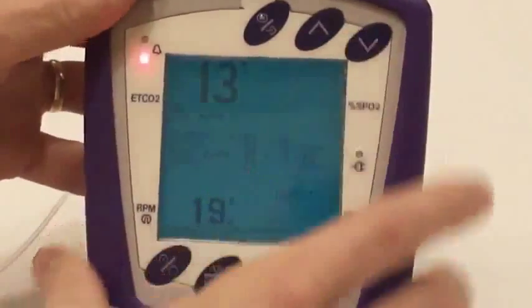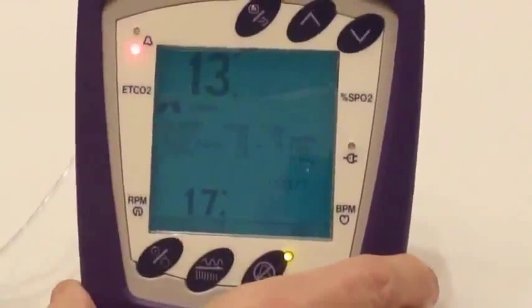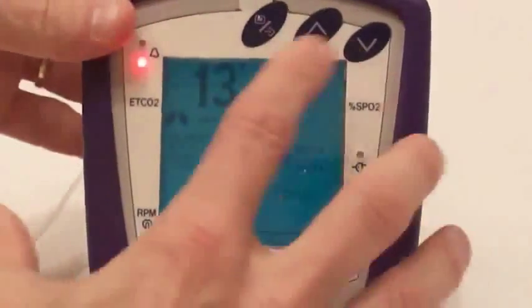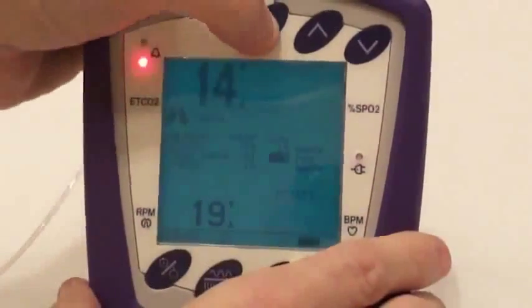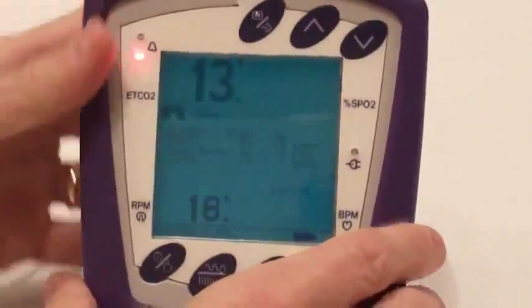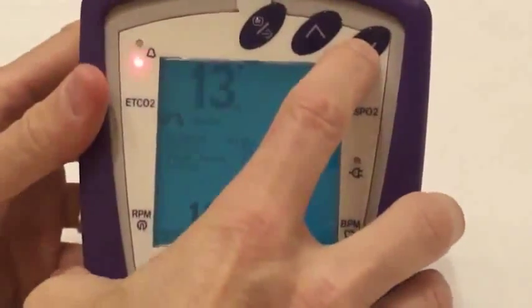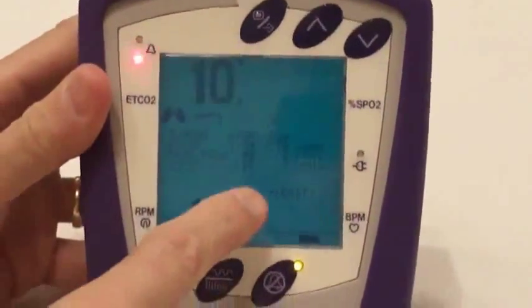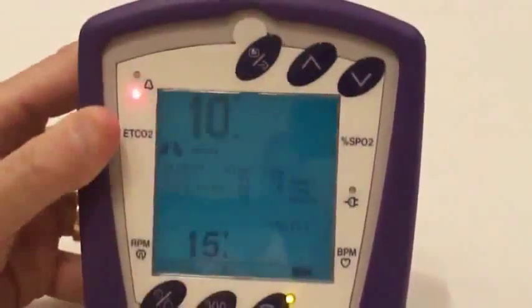Then the same thing on the low rating. Right now it's 5. We can just press the menu button, change it up or down, and then press the menu button to lock it in. To exit this we just press until the little arrow goes down to exit. Then we press the menu button again.